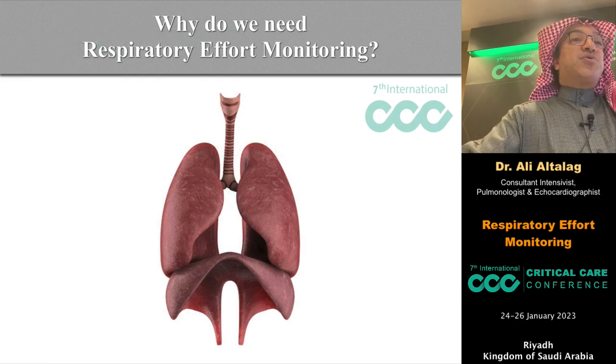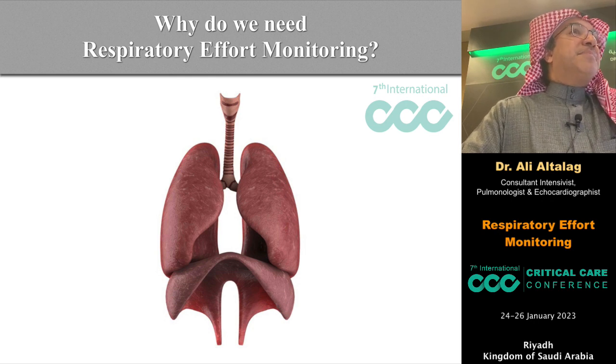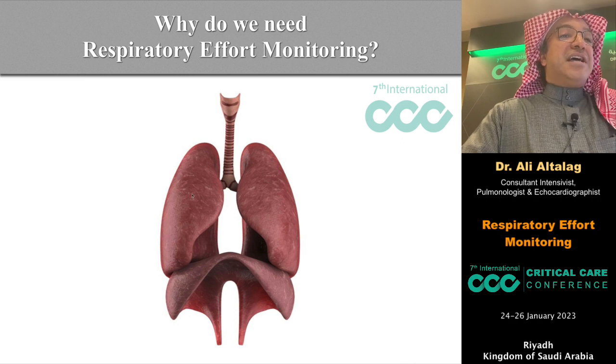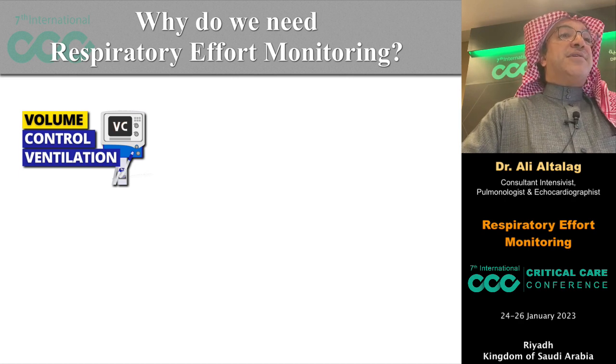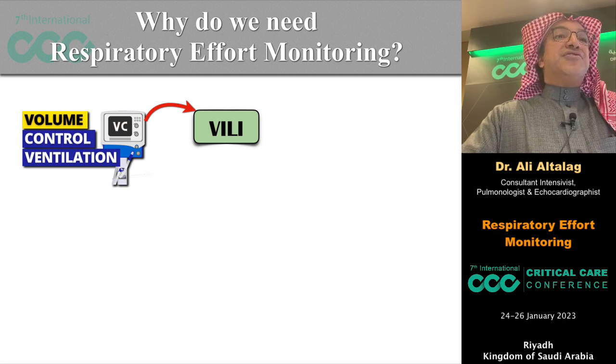And the first question I'd like to ask: why do we need respiratory effort monitoring? The reason is simply we need it to protect both the lung and the diaphragm. Now, we are all aware that control mode ventilation could be hazardous to our lungs. It can cause what we call VILI, ventilator-induced lung injury.